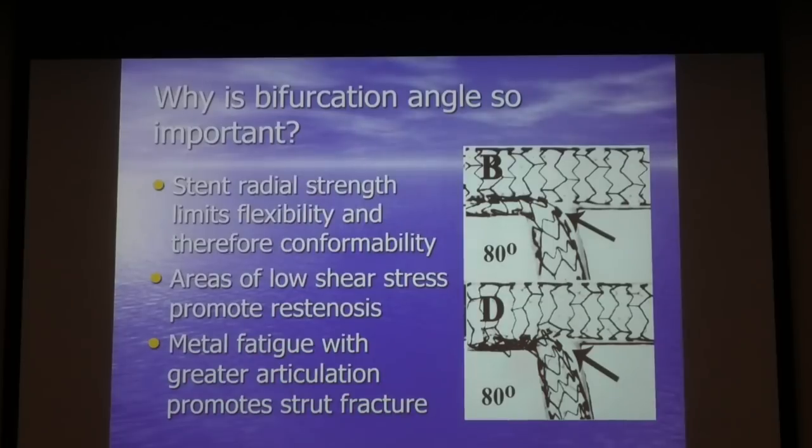So this really promotes strut fracture, and this will lead to complications, particularly restenosis, stent thrombosis and so forth. So these important points about angulation are extremely important to properly do PCI. PCI of the left main is an art like everything else, but it has a special art because if the patient comes back with a stent thrombosis of this, he's dead.